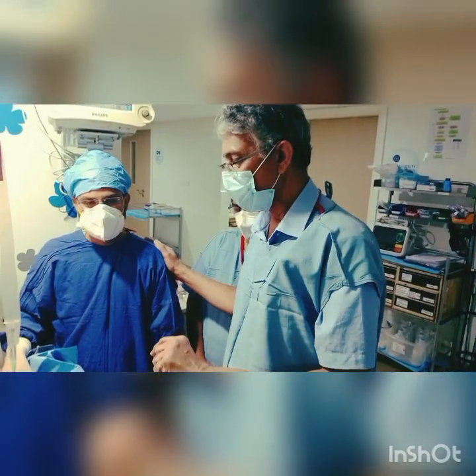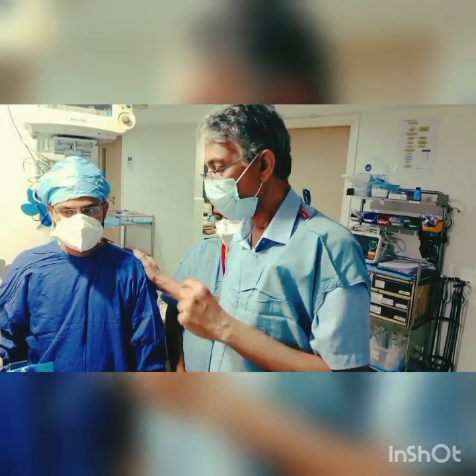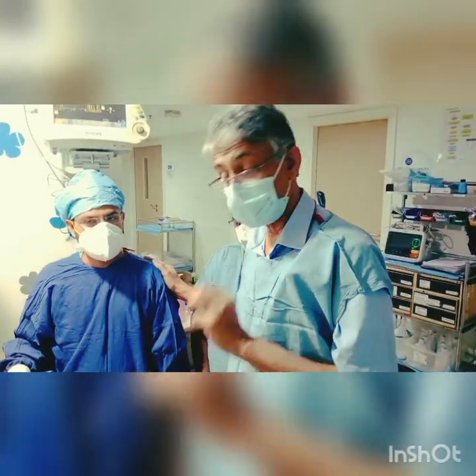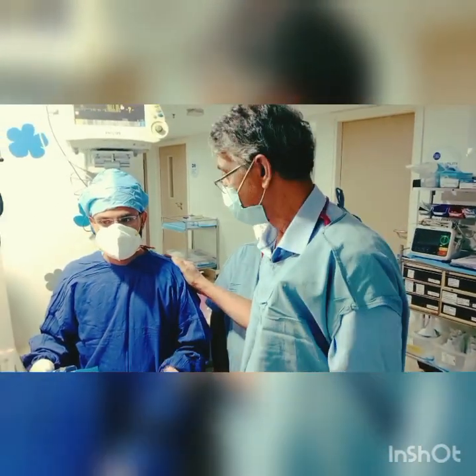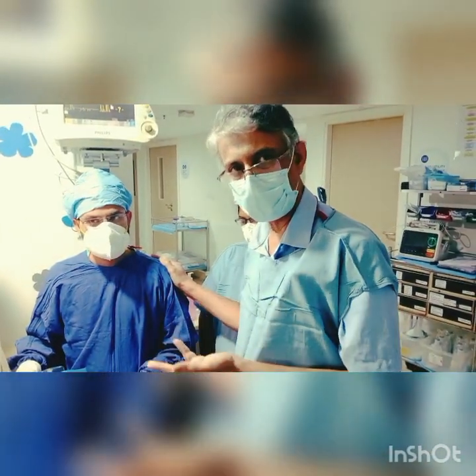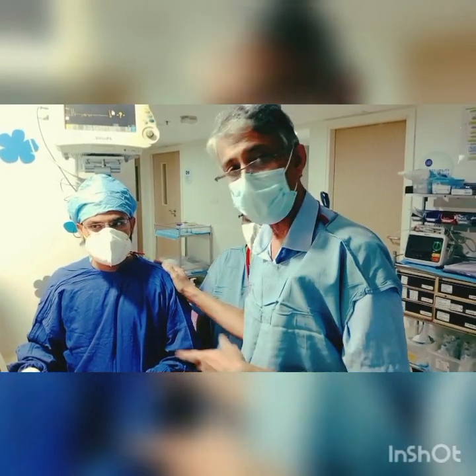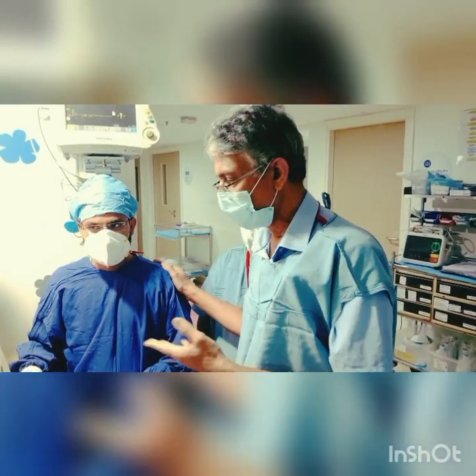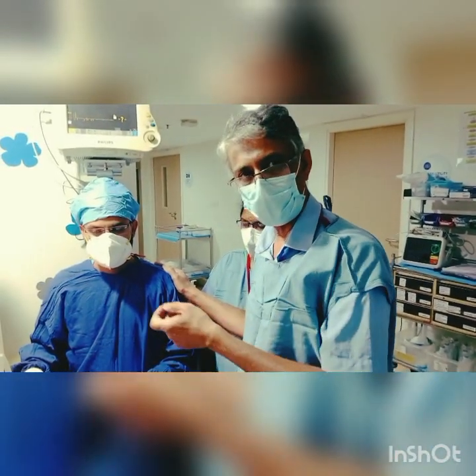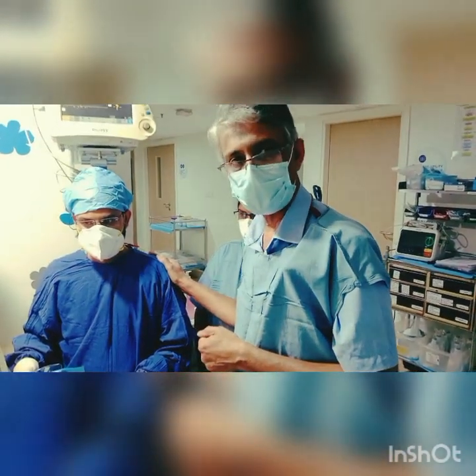What sometimes happens is you will find it traverses further inside, which may cause a cardiac tamponade. That is the reason — we had a scenario a few years back where we inserted a cannula, started to see a swinging heart rate and desaturation, and in the middle of the night found it was a cardiac tamponade. We were able to manage it successfully.